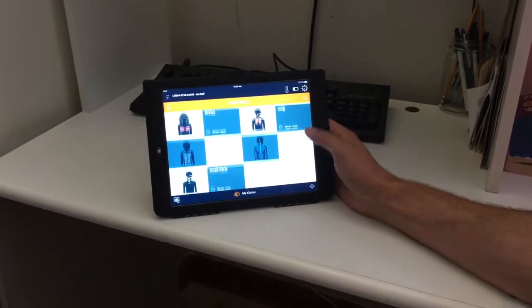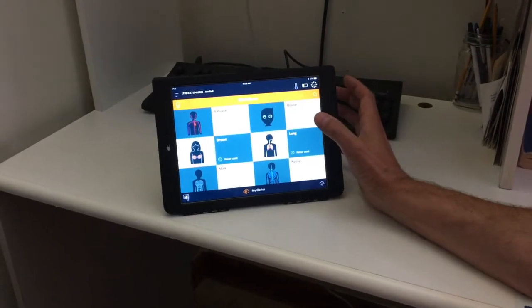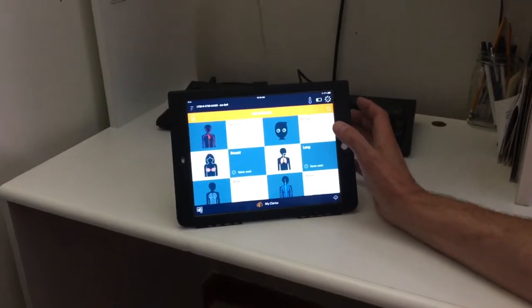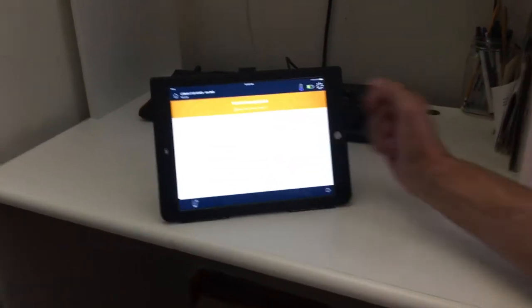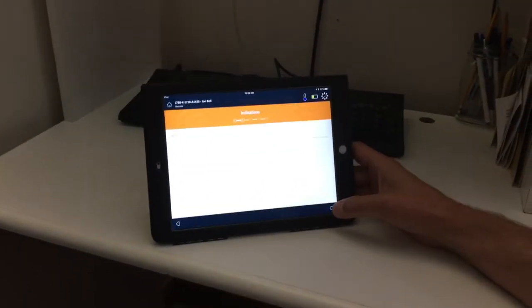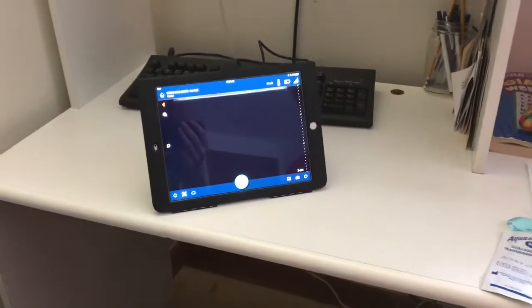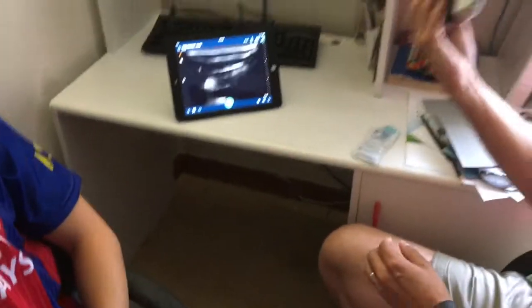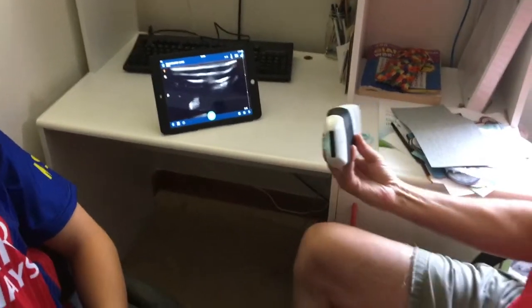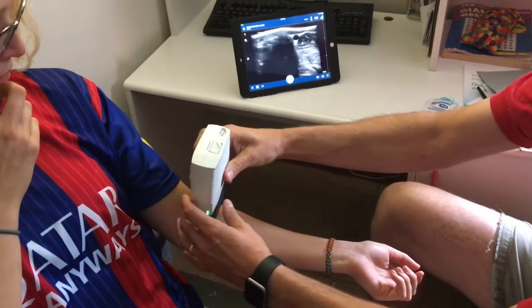Here we have our workflow, where you can select whatever you're trying to do and dial in all the settings for that specific application. We'll look at vascular — we can put in our patient identification and whatever we want. Now the probe is up and we're ready to start scanning.